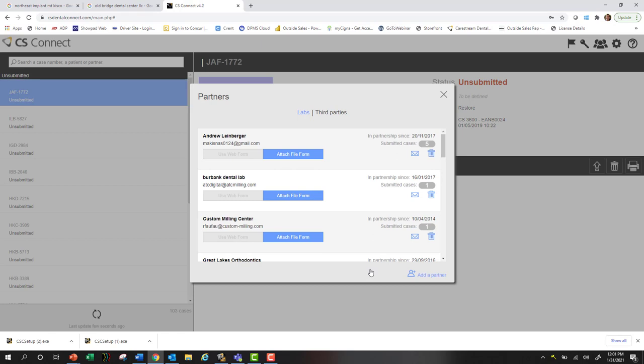When they accept, they'll be prompted to create their own free CS Connect lab-based account. Then at that point, they can begin receiving cases from you.